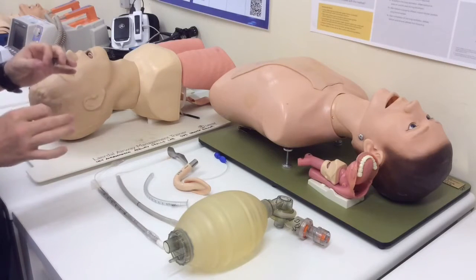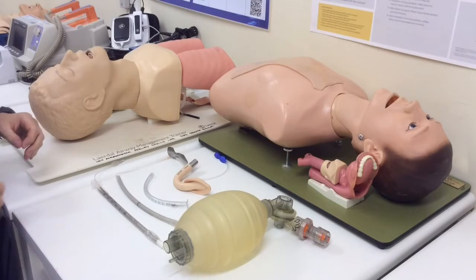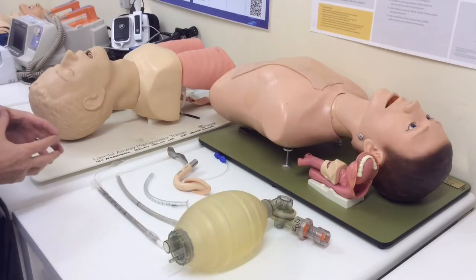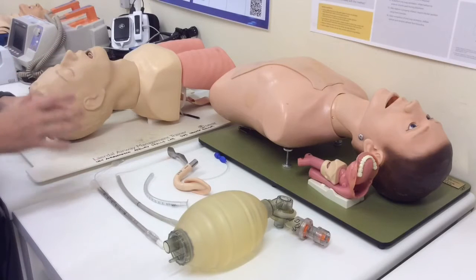to look at the technique for using the Fastrach intubating LMA. So there's some good videos out there and there's lots of literature on this, and I think this is an important device that you need to know.